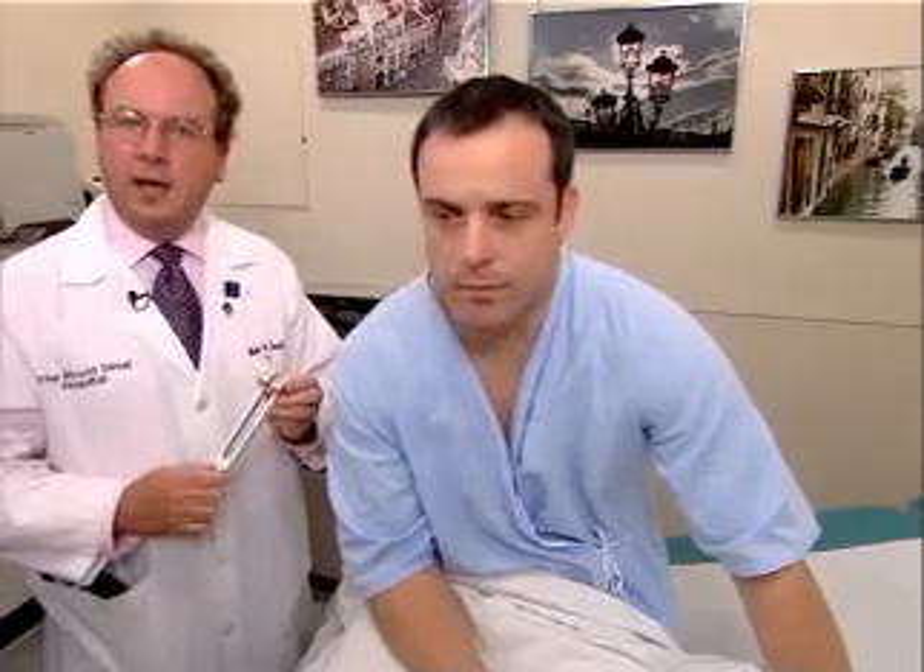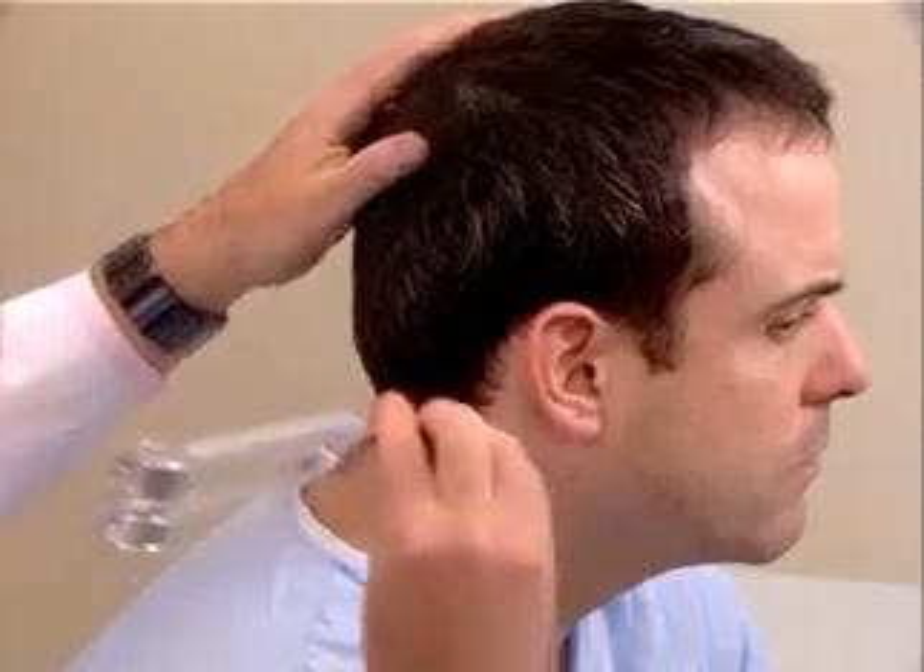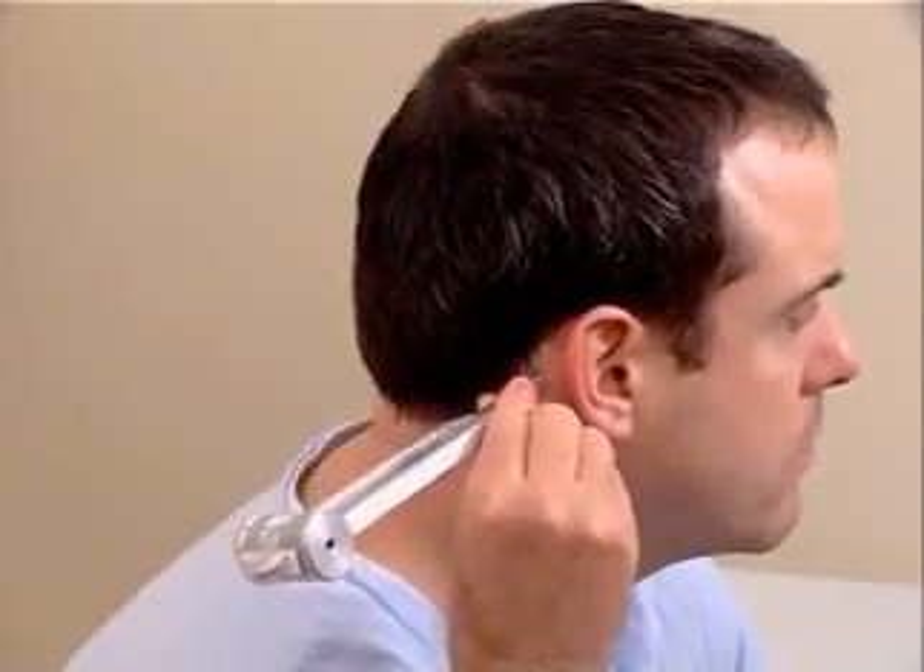We're now going to proceed with the evaluation of auditory acuity by a tuning fork test. Typically, one uses a 512 hertz tuning fork. This happens to be 128, which is certainly acceptable, but a 512 is generally the one which is used. There are two tuning fork tests, the Weber and the Rinne test. I'm going to demonstrate the Rinne test first. Strike the tuning fork by placing it into oscillation by striking the heel of your hand, and then placing the vibrating tuning fork on the mastoid process of the patient.